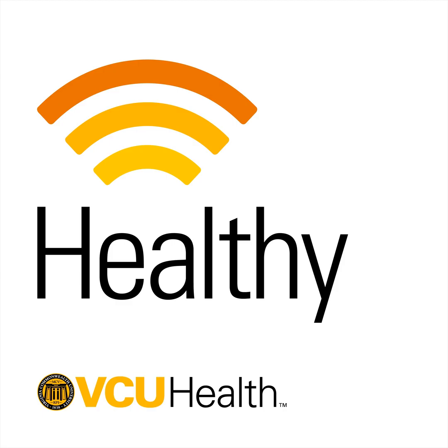So DBS has really changed the game in terms of essential tremor, and not just essential tremor, but many other movement disorders. And that is still the gold standard. But probably within the last 5 to 10 years, this newer technology called focused ultrasound has come along. And the thing to understand about focused ultrasound is that it is a new, safer, and more precise way of doing the old surgery, which is making a tiny lesion or a tiny hole in the brain, disrupting that same circuit. So we're targeting the same place in the brain that we did with radiofrequency ablation.